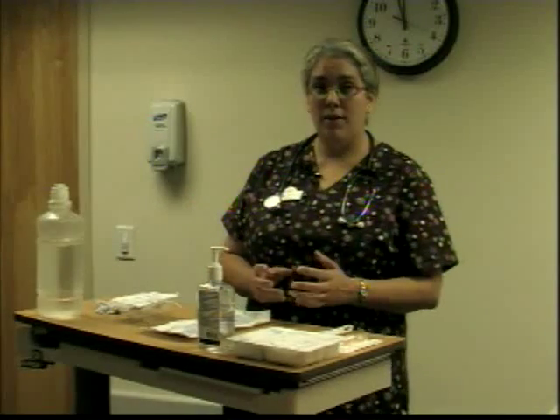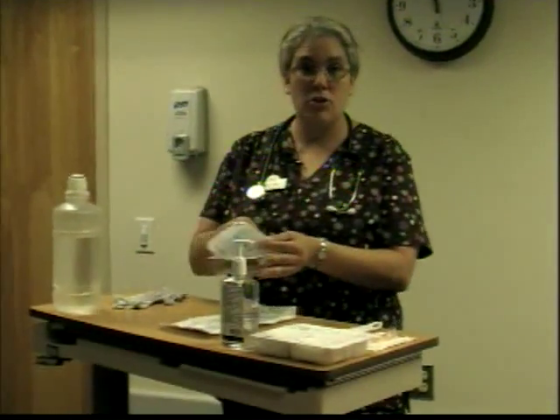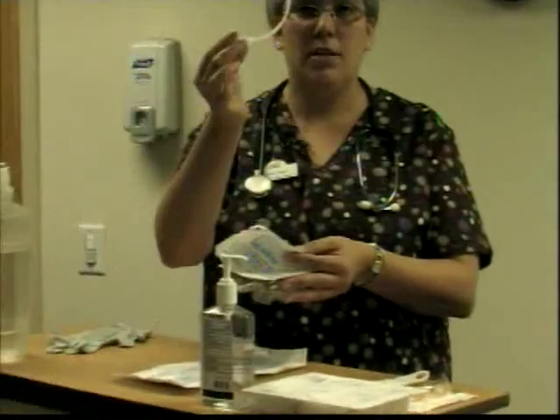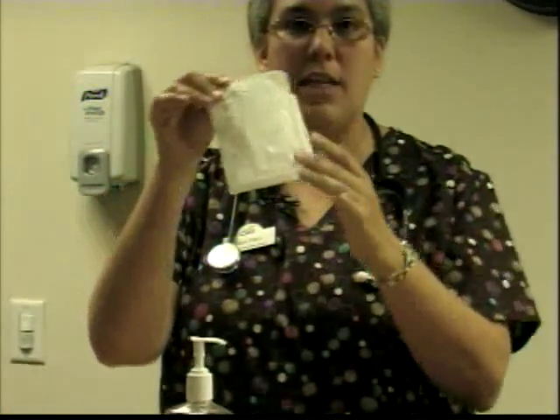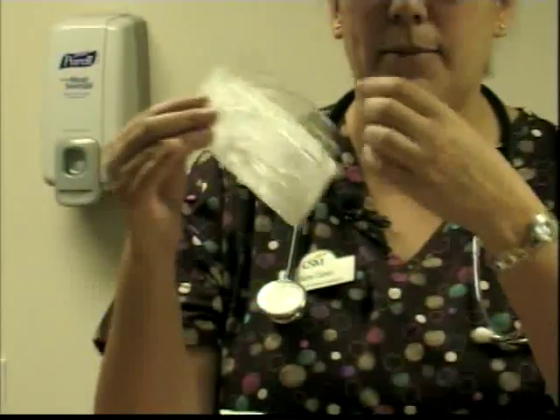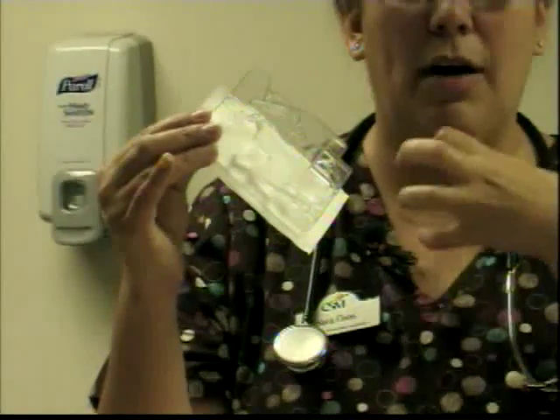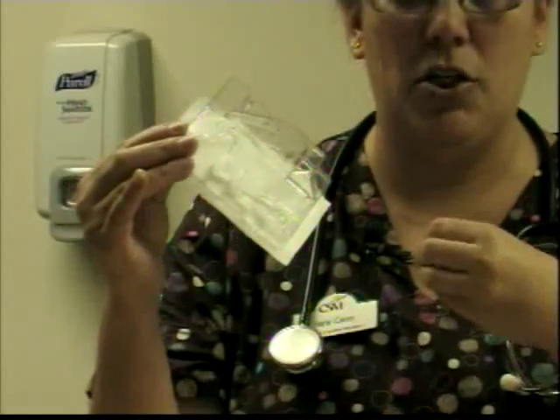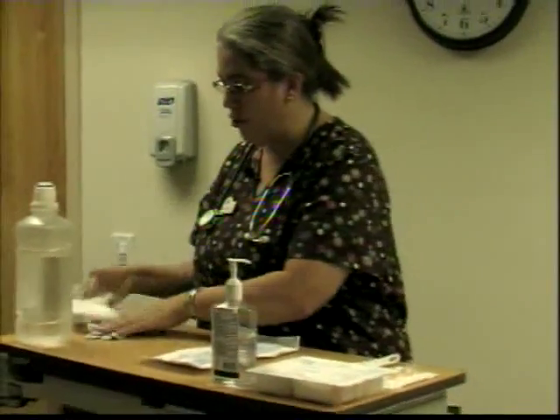Okay, so I'm going to give you the demonstration on doing the trach suctioning and the TrachCare. One of the things I wanted to give you a visual of is what I mentioned before, an obturator. This is the piece of equipment that is kept in a sealed container taped to the wall. If the tracheostomy becomes dislodged and comes out, that's the piece of equipment you'll put into the opening, the stoma. It allows the stoma to remain open until the physician can come in. And of course, you have to stay with the patient and assess the respiratory status. So I just wanted to give you a visual for that.